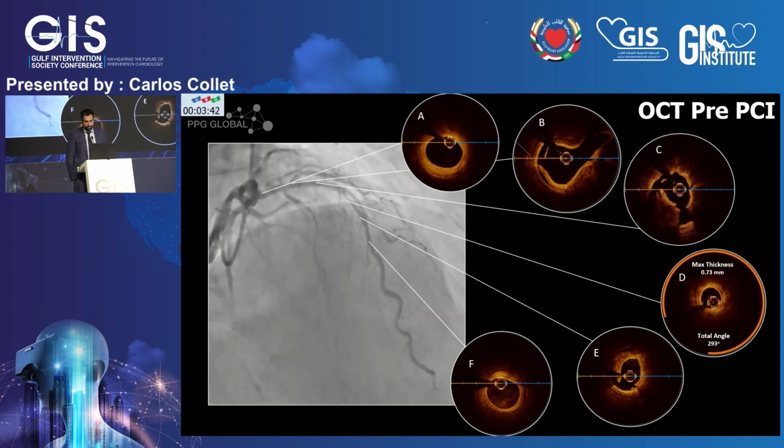Now inside that, at B, you have a dissection, right, which is the mechanism of the balloon preparation. And at C, you have very nice calcium fractures. At D, you have unprepared lesion. You'll notice that there's a segment of calcium. Even though we spent a lot of time and energy fracturing this, there's a section of calcium that has not yielded, and at E, there's another calcium fracture. So the focus before placing a stent must be lesion preparation in segment D because of the risk of underexpansion.